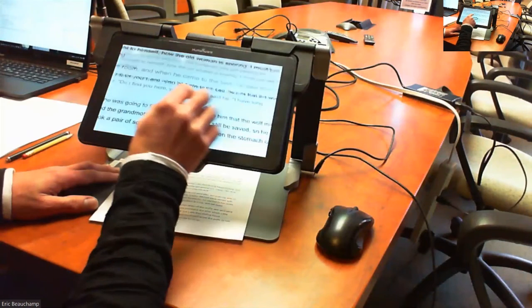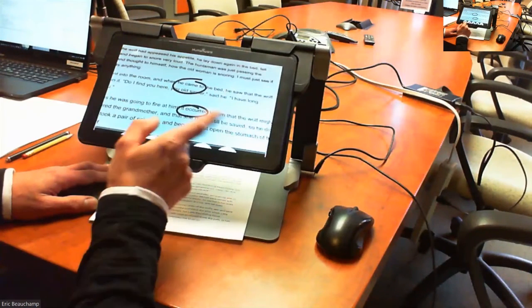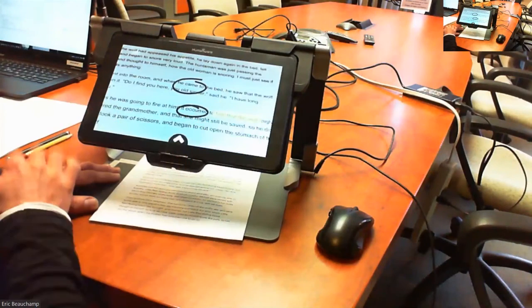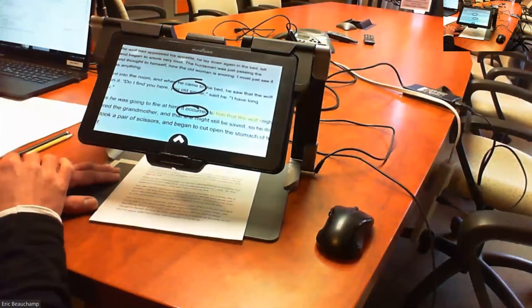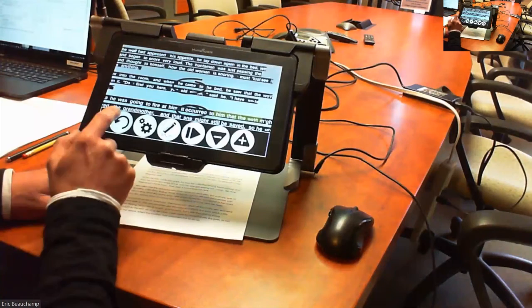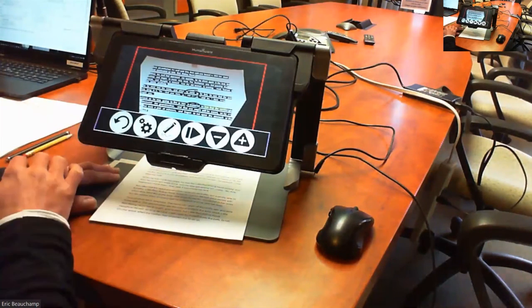So you can zoom out, circle that. You can circle, or you can change it to a highlighter and just highlight something on the text. You can start taking notes also on the text for older students. Okay, so that can be done. If you want to circle something on a distance capture, you can do that.